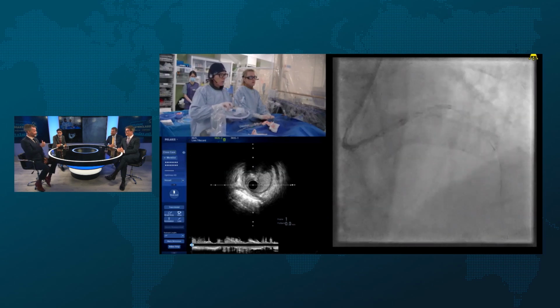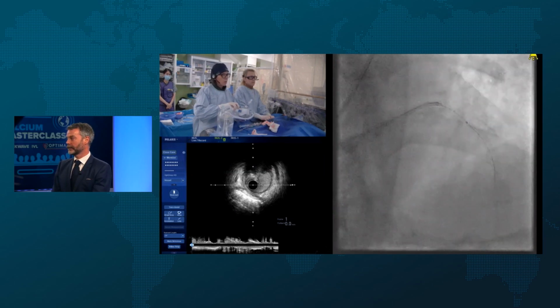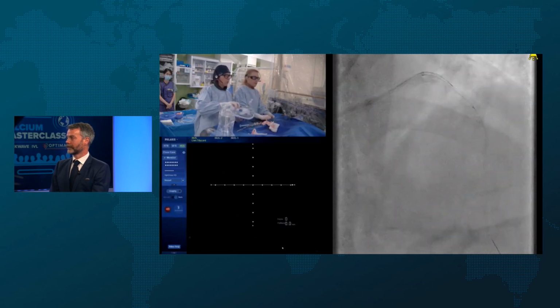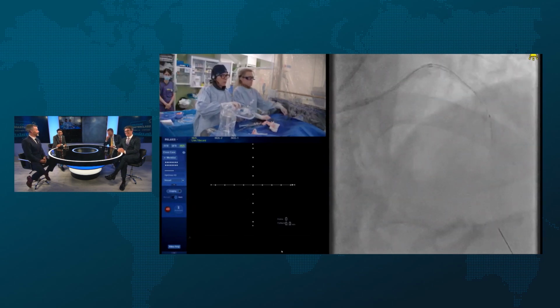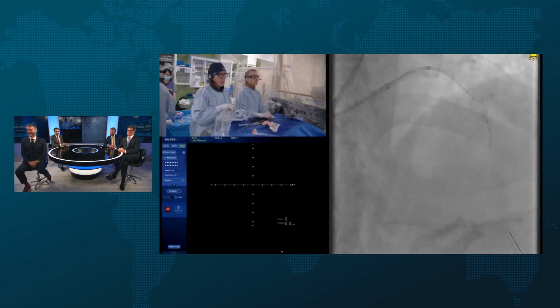Personally, it's a kind of pacifier, isn't it, in US terms? 100%. We know the stent's going to go to that size, and maybe it's not required, but it does give you that reassurance. It's all the way down. Pacifier. Well, that's an American term, isn't it? So if we got some, we call it a dummy, but I thought you'd think I was talking about you. No. Just today is a day of learning for me. This has been quite lovely.